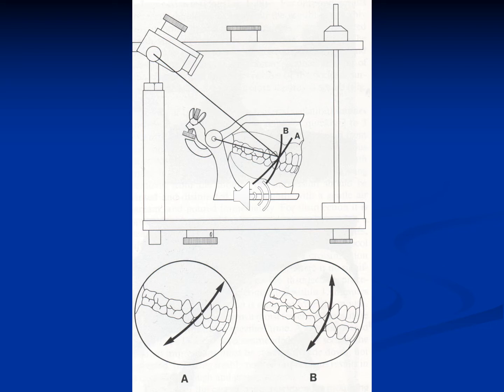following the arc B, while when we place them inside the patient's mouth and the patient's mouth is going to close according to arc A, we'll end up, as we can see in the lower right segment, with an interference that will prevent smooth, proper closure, as could have been seen on the simple hinge articulator. And that is a representation of the error that can happen simply by not using an articulator that resembles the patient's movement to a high degree of accuracy.